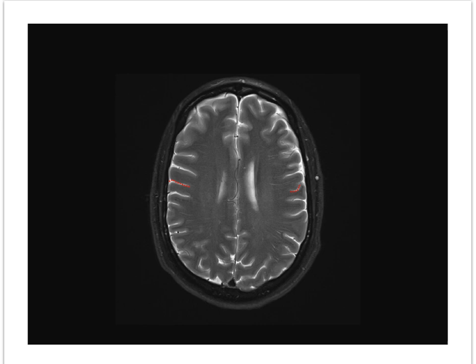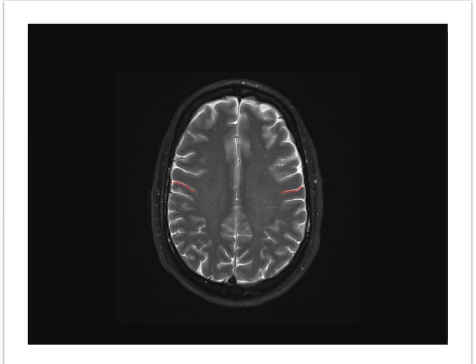On this image, we have marked the central sulcus, but it is not possible to reliably identify it as such on this image alone. Instead, we need to identify it on higher images and then follow it down. White matter above the ventricles is sometimes referred to as centrum semiovale, and this white matter conducts fibers toward cortex and makes connections between adjacent regions with association fibers. The central sulci are marked, but this must be done by tracing from above.